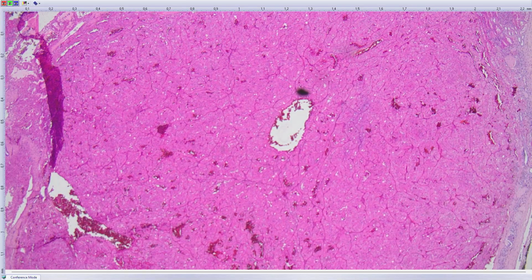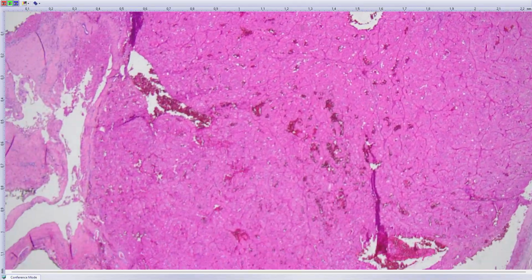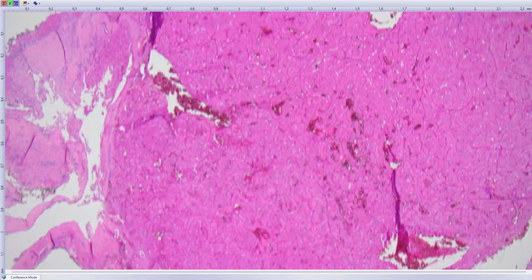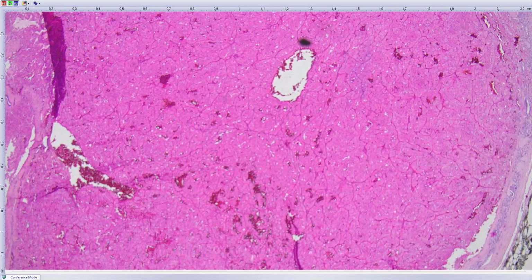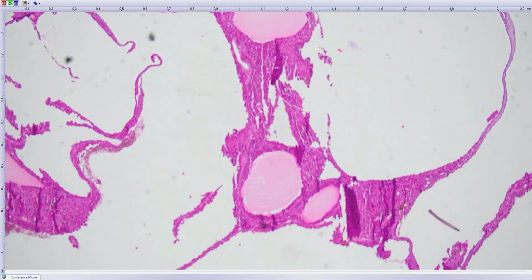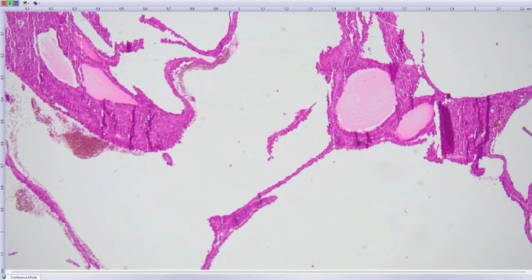First, low magnification: the tumor was relatively small, about 2.5 centimeters in the greatest diameter. You can see that it is a pink tumor with focally solid architecture, and in another block you can see more cystic architecture. Okay, we will go closer.